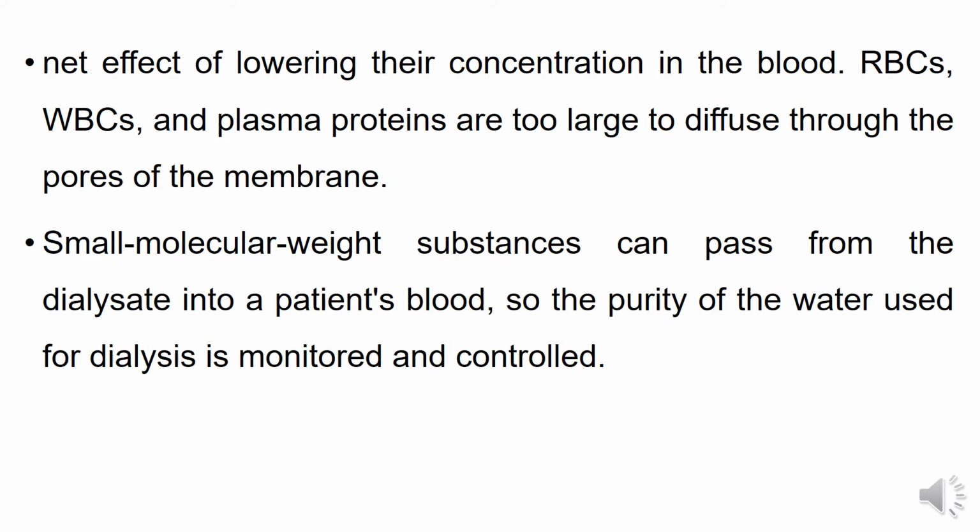In the previous slide we discussed that the three main principles are diffusion, osmosis, and ultrafiltration. By using these three techniques we do the dialysis procedure. The net effect of these three principles is that through this method we are able to reduce the waste content of the blood.